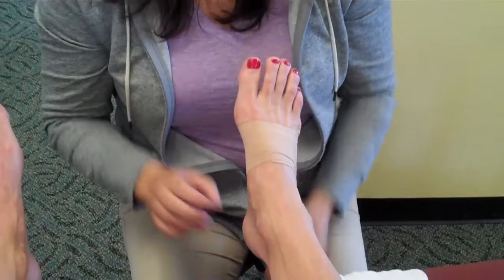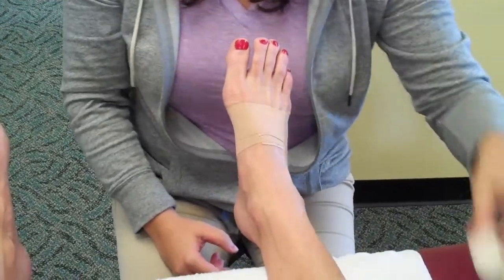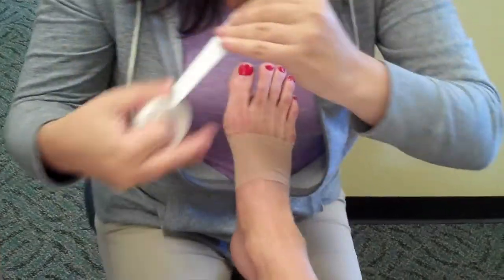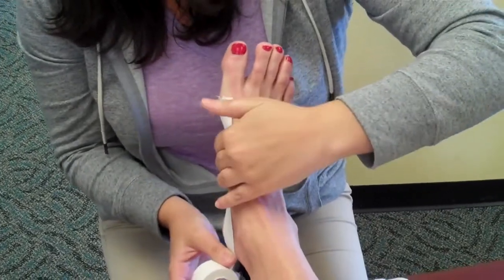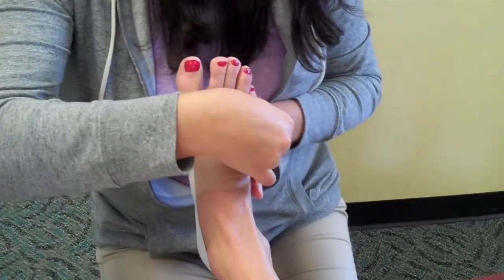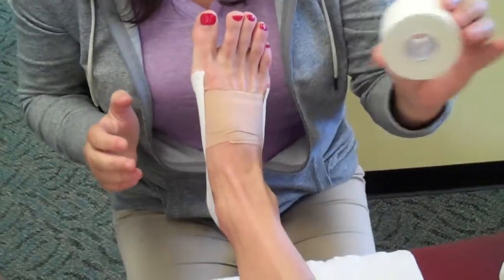Now we're going to finish off this technique with actual low dye. I'm going to take the one inch athletic tape, start at the joint of the big toe, wrap all the way around the foot, and rip on the other side.